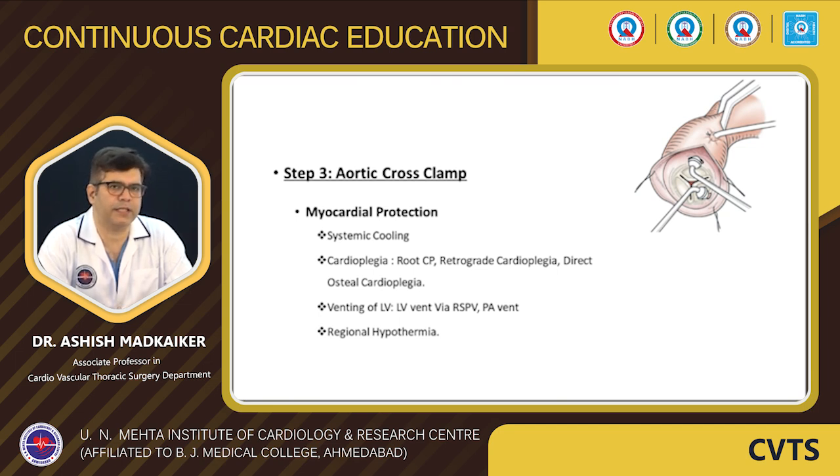Similarly, there are various choices of cardioplegia solutions which are available. We can use blood cardioplegia, we can use crystalloid cardioplegia, we can use del Nido cardioplegia. So these are different types of cardioplegia which are available, and depending on surgeon preference and the patient's disease, we need to make an appropriate choice.